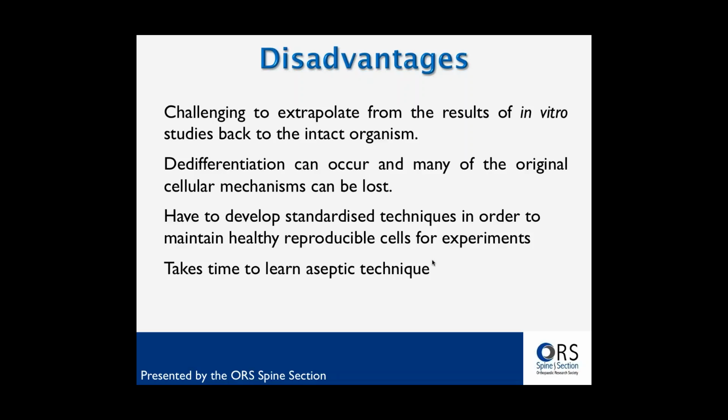Of course, it takes time to learn aseptic conditions, especially for those who are just starting cell culture. And this is basically not limited to disc cells. So this is another problem in the disc.